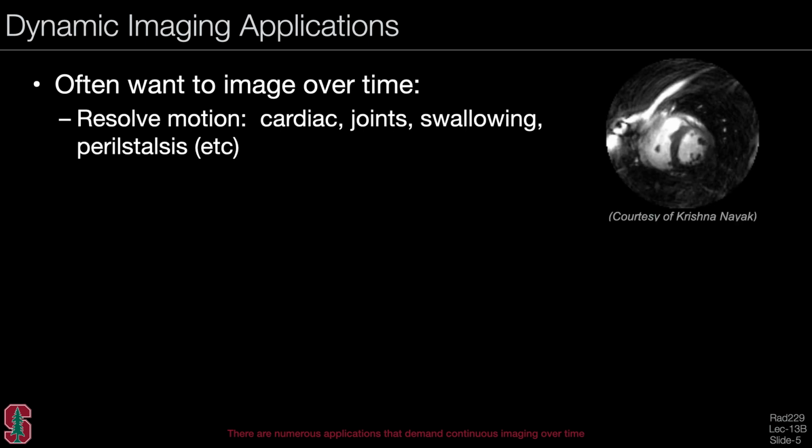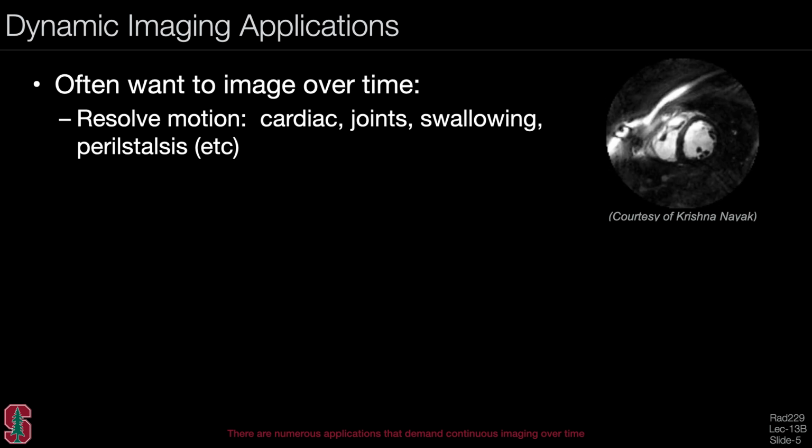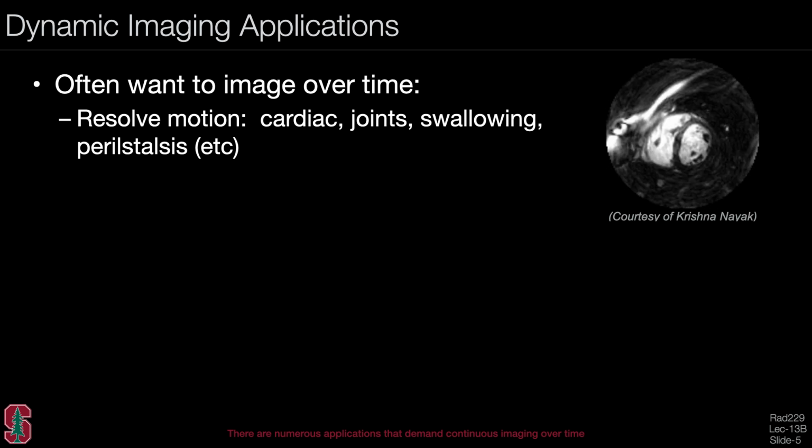Often we want to consider dynamic imaging applications where we image over time. We might want to resolve motion, such as cardiac motion, joint motion, swallowing, peristalsis, or other effects. This is an image showing the heart beating, where we want to resolve the cardiac motion.